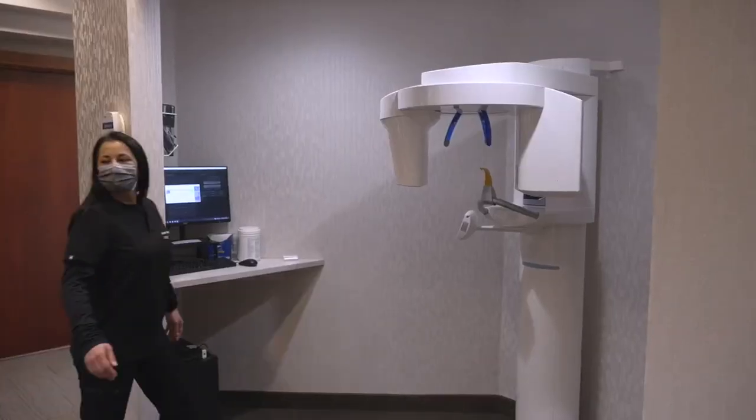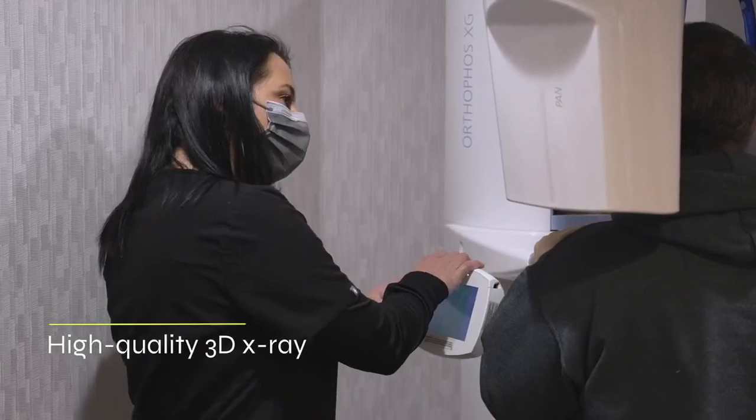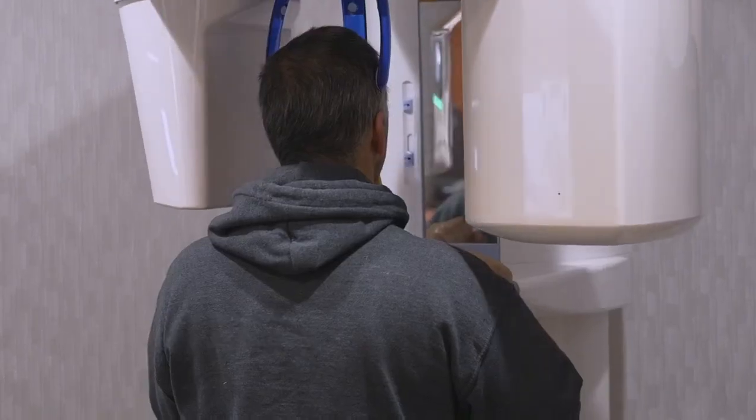My name is Mike Scramsted. I'm a dentist in Orono, Minnesota. I've been using CEREC technology since 2003. Let's go through the whole entire implant workflow. When a patient comes to my office, the very first thing we're going to do in the workflow is take a CBCT. We want to get that three-dimensional bone data so we can get that implant in there accurately.